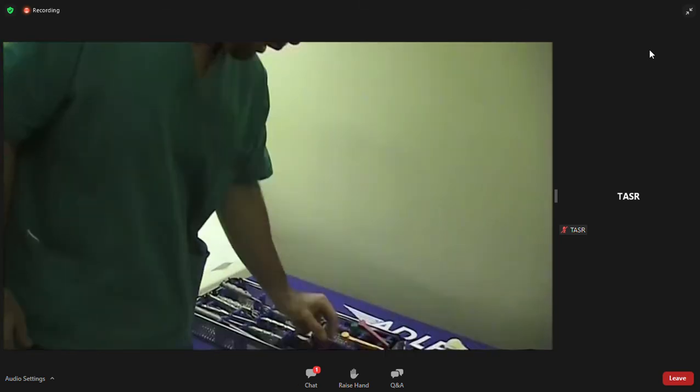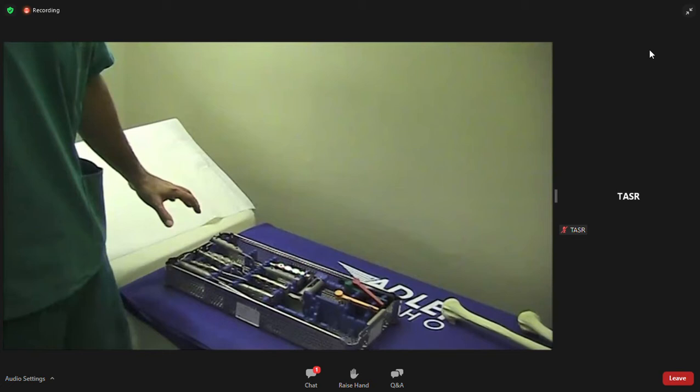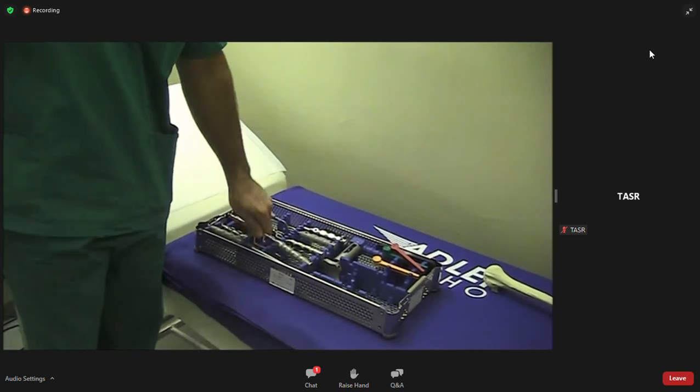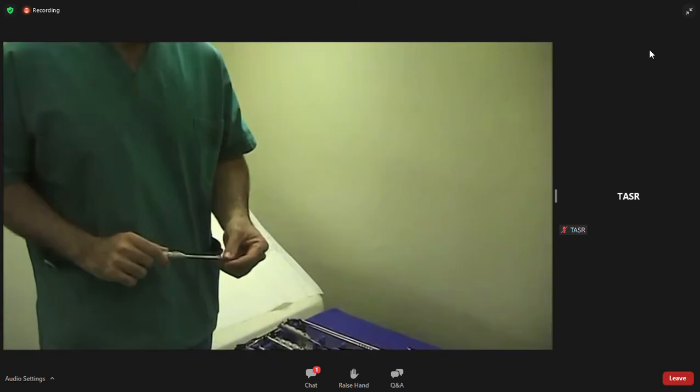So I invite you to use it as well. Apart from this, all the rest are instruments to implant the prosthesis and also to test if the mechanism of blockage of the head into the stem has been working with this little fork.